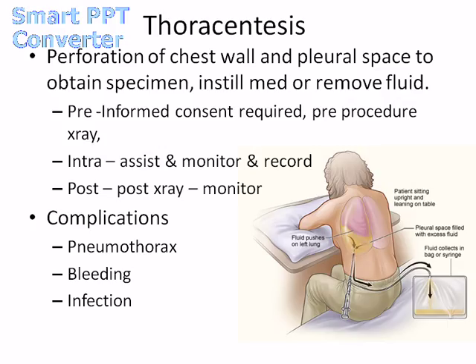The patient is positioned as in this picture, sitting up with their arms and shoulders raised and supported on pillows on an overbed table, leaning forward. If we're down in the radiology suite, we have them still sitting up, leaning forward. And we want to instruct the patient to be very still, because we don't want them to jerk around, because we could put a lung down with this needle, or the physician could, not we. So we're going to assist the doctor.